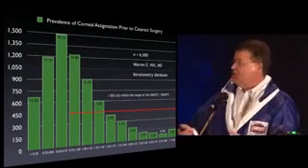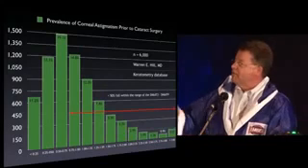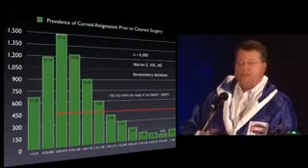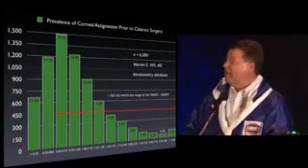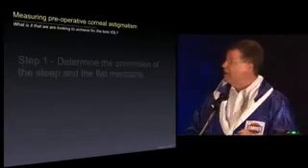For the T3 through the T9, that's a little bit more than 50% of patients you're going to have access to in your patient population. But when you start adding the T2, that's 70% of patients who are toric candidates. So you need to have some mechanism by which things can be very, very accurate.